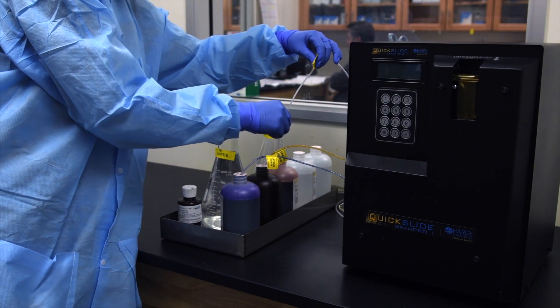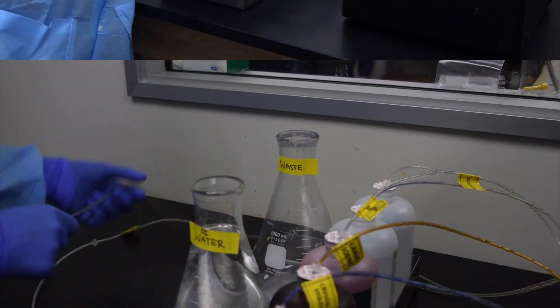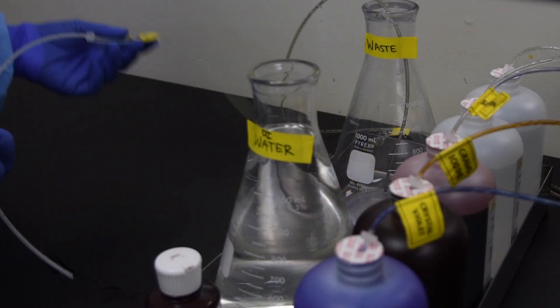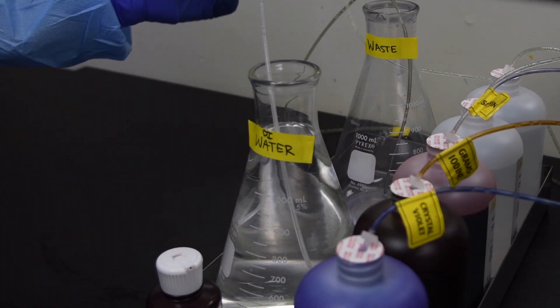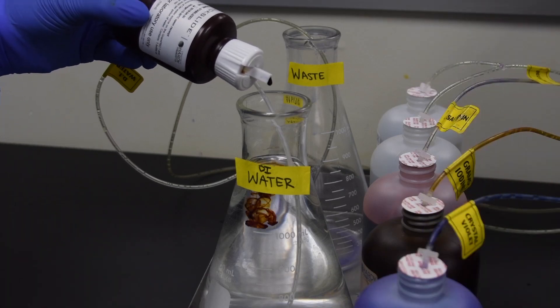Ensure all cannulas are completely submerged in the reagents. Insert the waste line into the waste container. Insert the water cannula into the DI water container and supplement the DI water container with 10 drops of iodine per gallon of water.